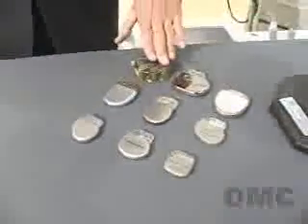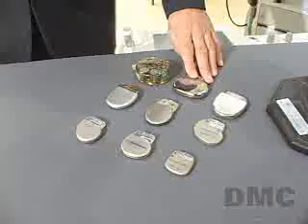The lead's working great. She's running around doing stuff that she wants to do, and we're just monitoring the battery. And when the battery drains, as they all will because they're lithium iodide batteries, then we'll make a simple little incision, take out the old can of the pacemaker, put another one in, and be all set.